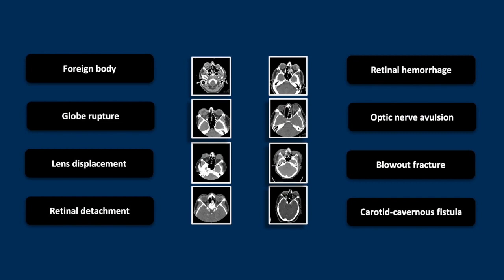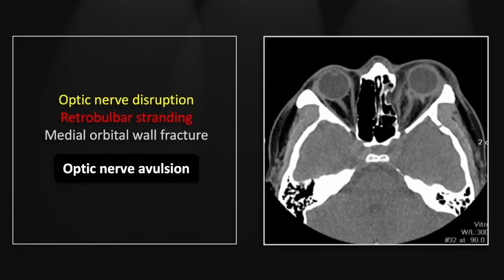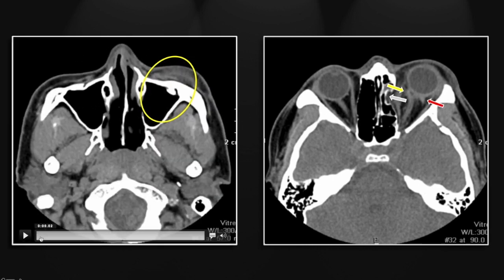The next case is a pretty unusual injury: an optic nerve avulsion from a direct blow. You can see the optic nerve is detached from its appropriate position on the posterior aspect of the globe. There is retrobulbar stranding that should call your attention to this abnormality, and in addition there is displacement of the medial orbital wall consistent with a blowout-type fracture. The specific displacement of the optic nerve could be very difficult to spot.